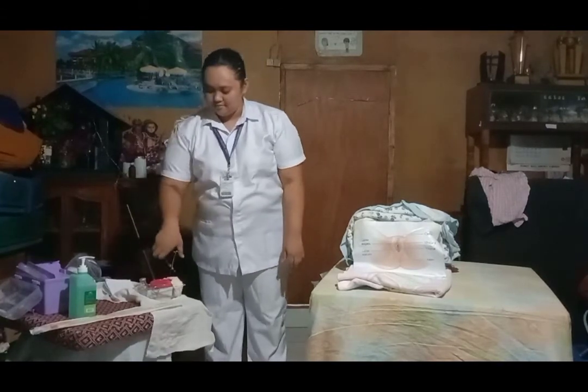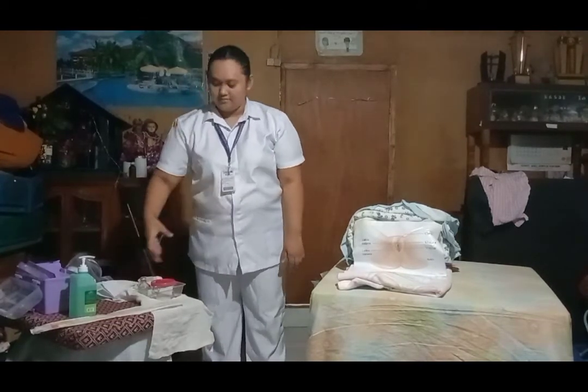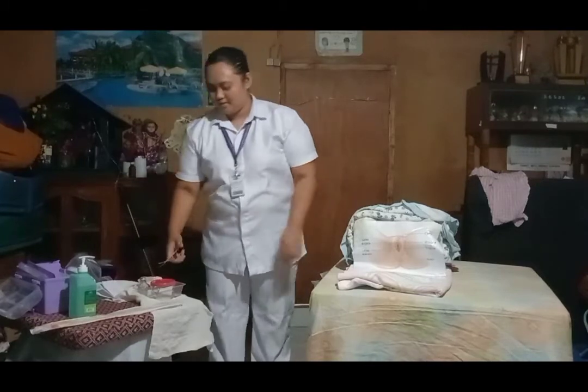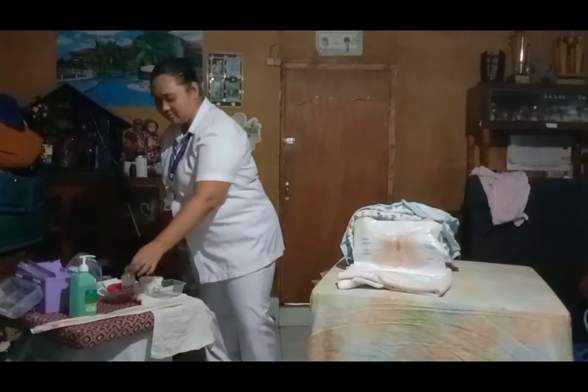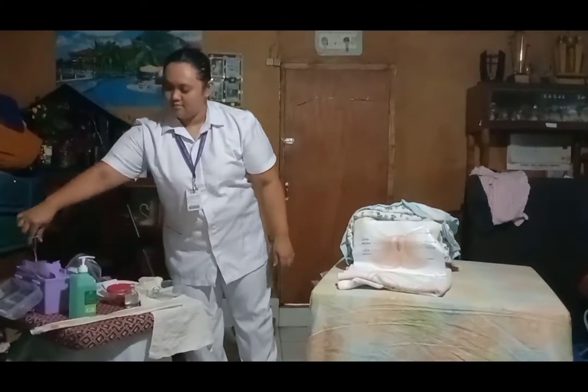So inside my tray set, I have the eye sheet, the sterile gloves, cotton balls with cleansing solution, refilled water, a 10 cc syringe, which I'm going to use to inflate the balloon of the urinary catheter.